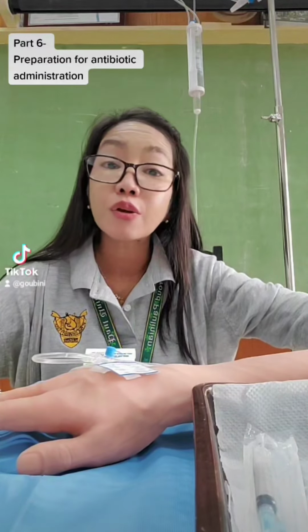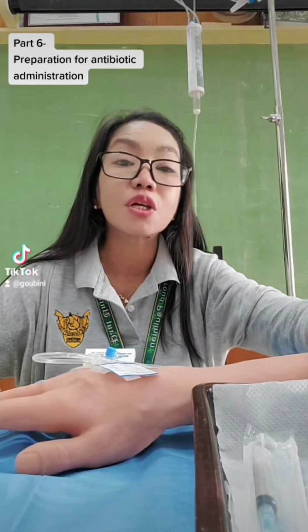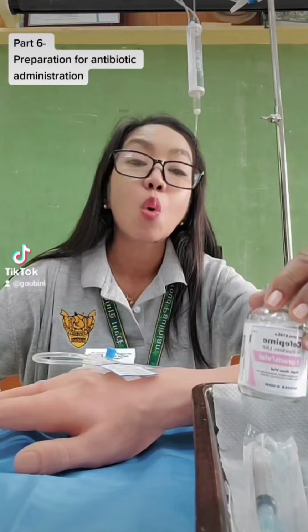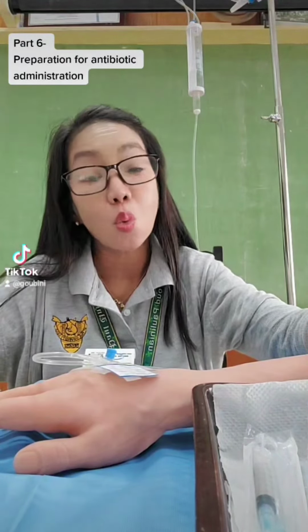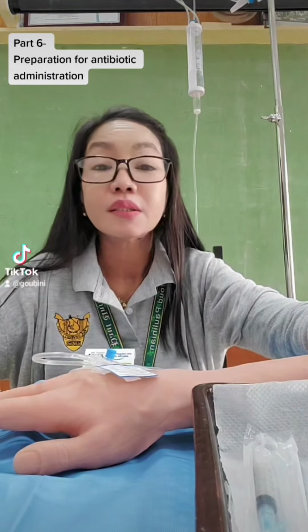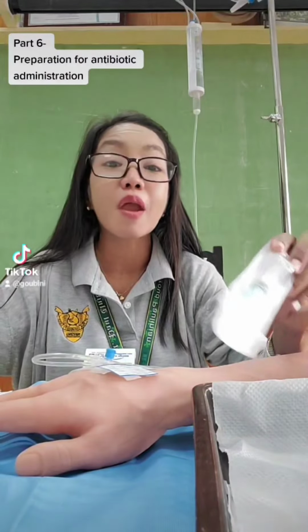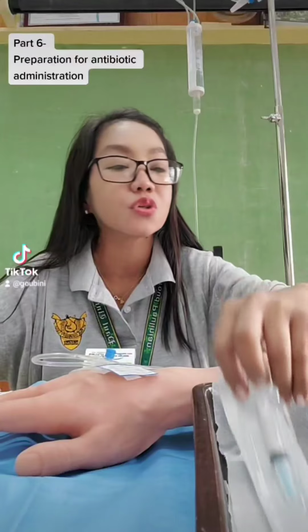You need to prepare the things that you need. Of course, you need your medication in powder form. It's Cefepime 1 gram. The stock available on hand is 1 gram per vial. And you have your syringe and your spare needle, just in case it gets contaminated, you will have to change your needle.